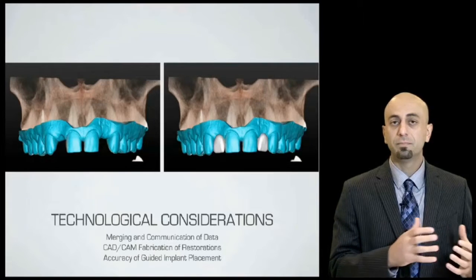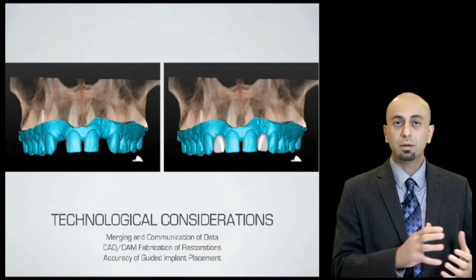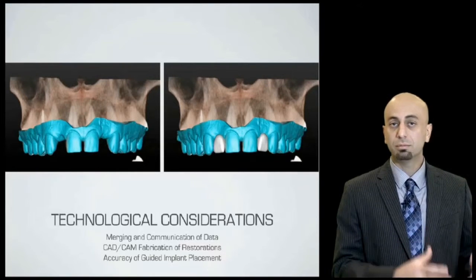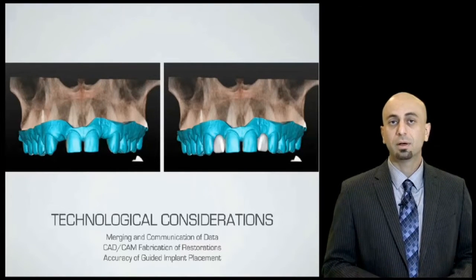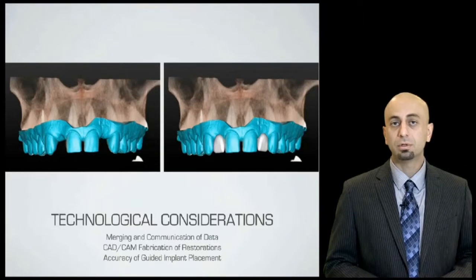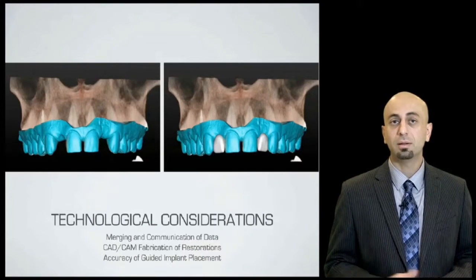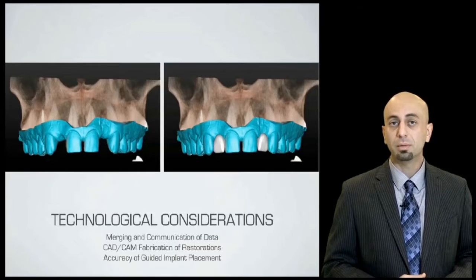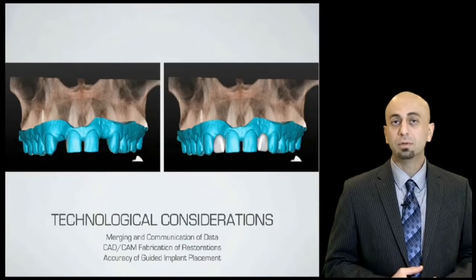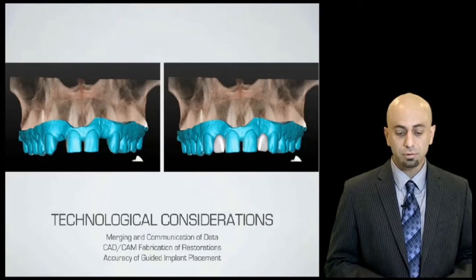And essentially, we are top-heavy in terms of treatment planning, and once the treatment plan is completed, the patient gets the benefit of a streamlined approach and delivery of the implant and the temporary abutment or a custom final abutment or even a final crown at the time of the implant surgery.